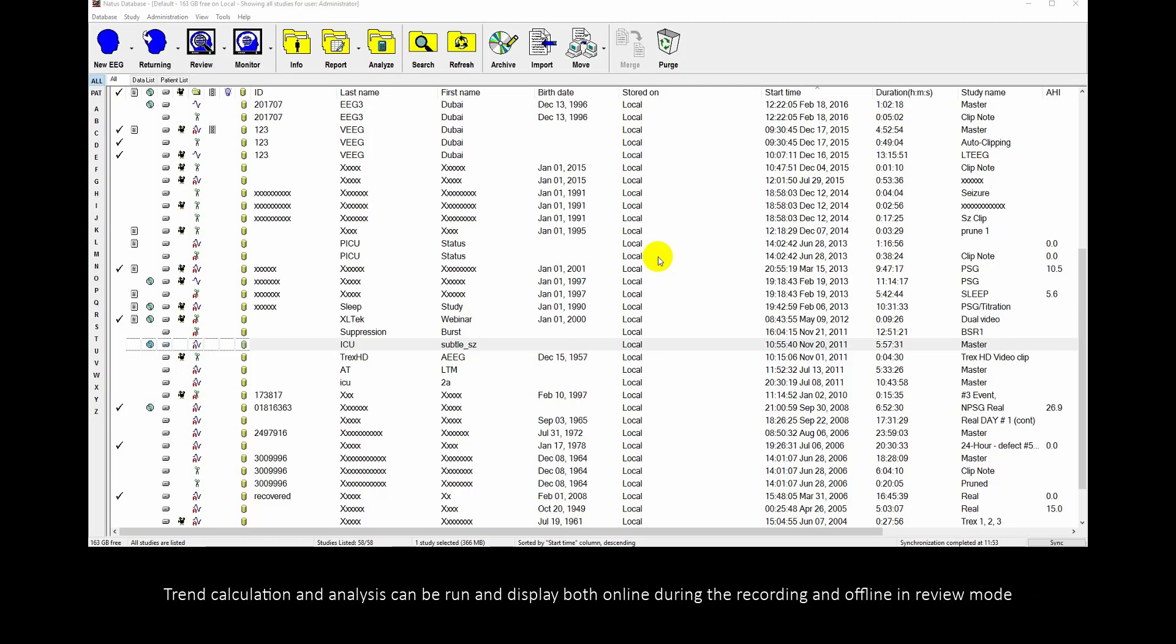Trend Calculation and Analysis can be run and displayed both online during the recording and offline in Review Mode.